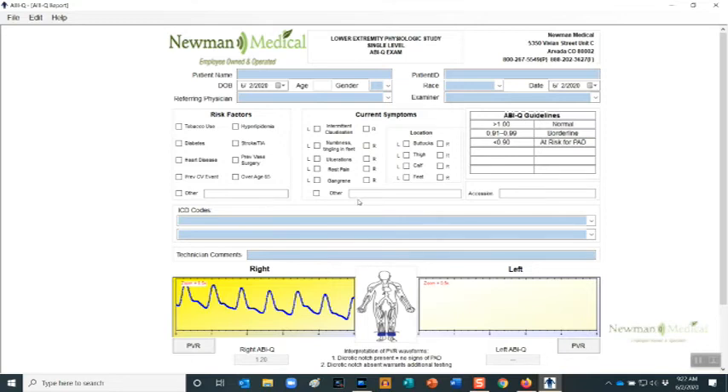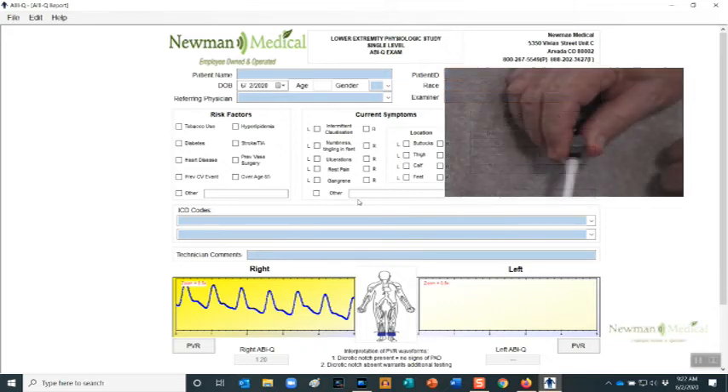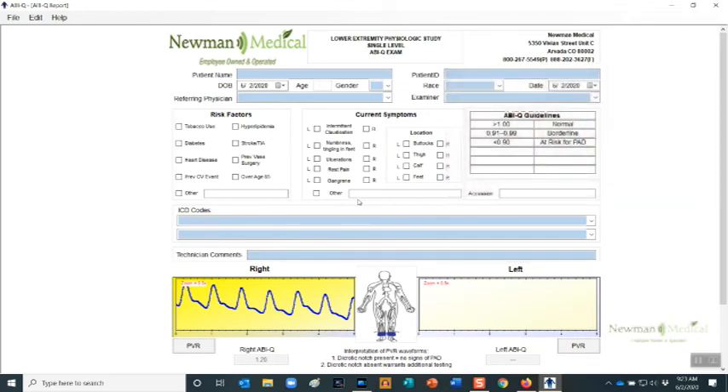If you are not satisfied with the waveform, leave the cuff inflated in the green and click on the Get Waveform button again to overwrite the previous waveform. Release the air in the cuff and move the hose to the left leg cuff. On your computer keyboard, press the Tab key to highlight the left leg PVR section, or simply click the left leg PVR button. Repeat the waveform sequence for the other leg.